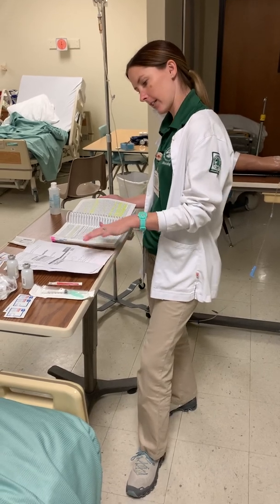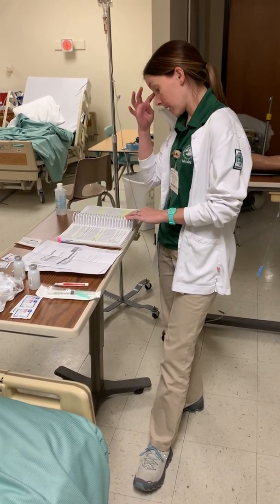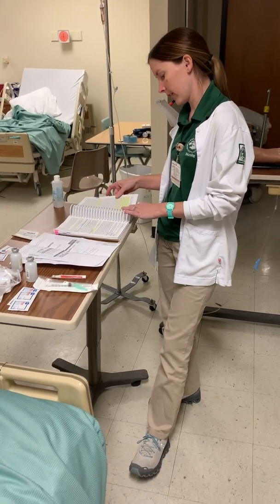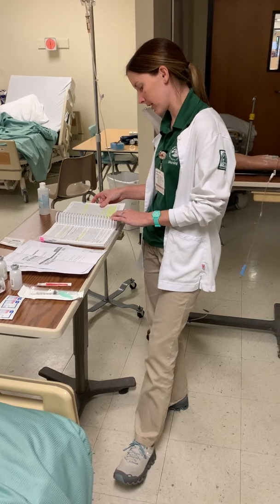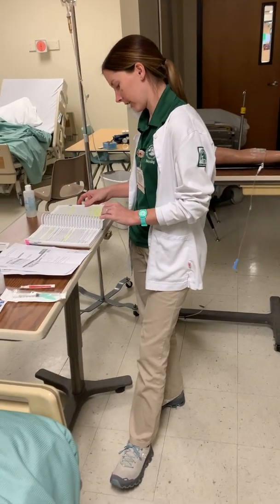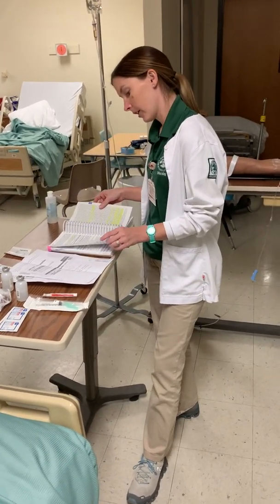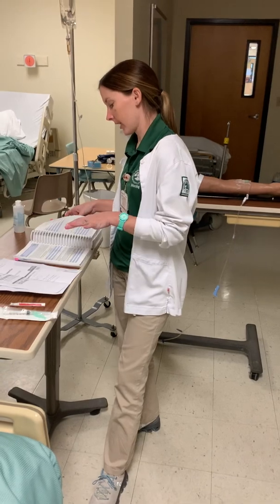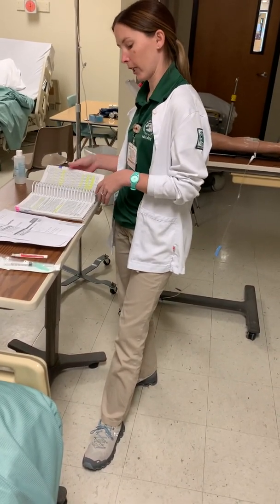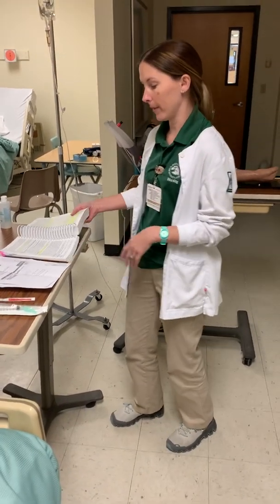And also, since this is a digoxin pediatric dose, it says the earliest and most frequent manifestation of DIG toxicity in infants and children is the appearance of cardiac arrhythmias, including sinus bradycardia, and EKG monitoring is recommended in pediatric patients. So we know that our drug is a safe dose, we know what to dilute it with, we know how fast to give it, and we know what to watch for with our patient. So now we are ready to start preparing our equipment.